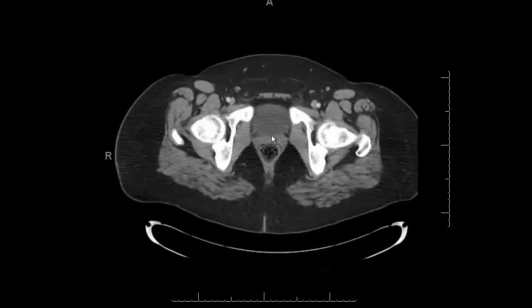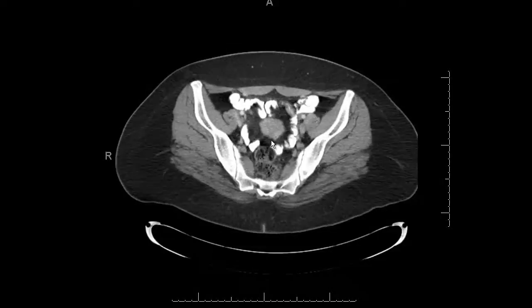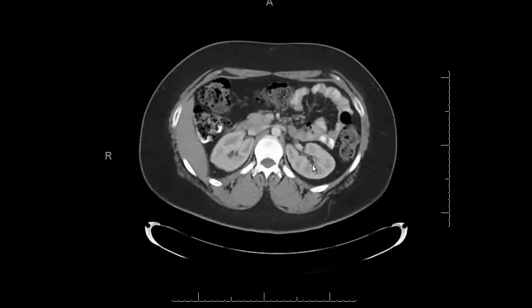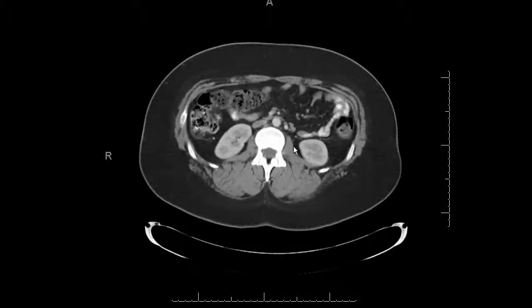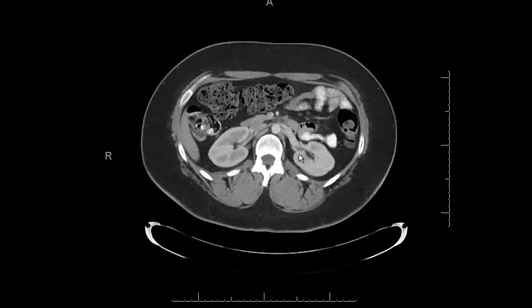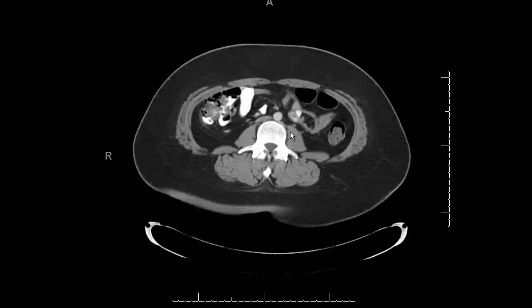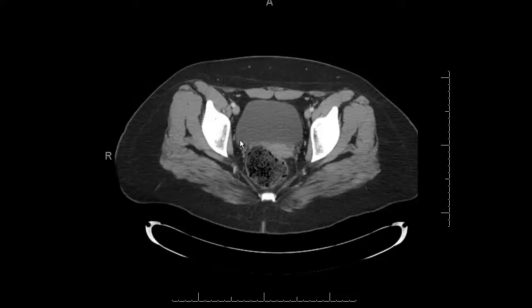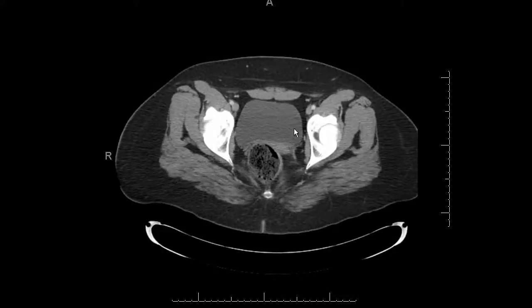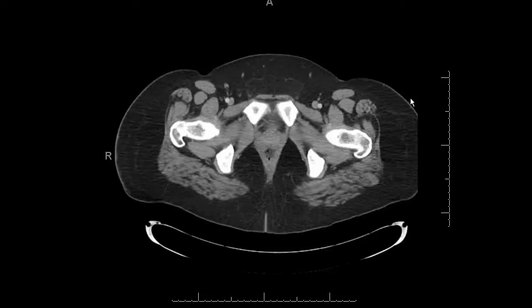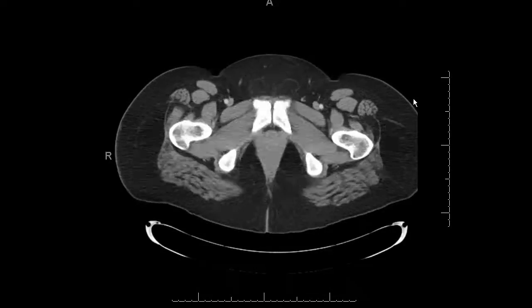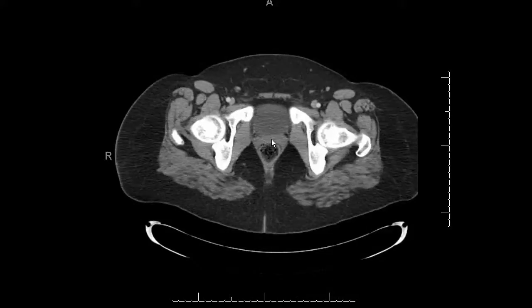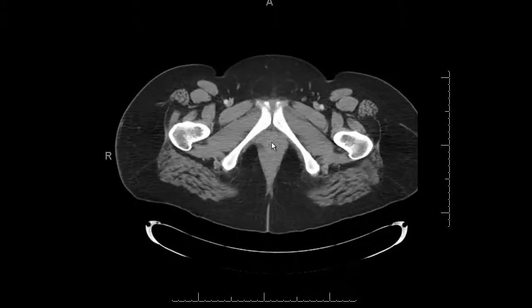Then I check the urinary bladder and look for the ureters. You can find them by looking at the base of the bladder and following them up, or start at the renal hila and scroll down — if they're small like this, it's probably normal. Follow the ureters to the bladder, make sure the walls are not thick and there are no masses. If you do see a mass, the first follow-up study I'd do is an ultrasound — it's very good for characterizing bladder findings.